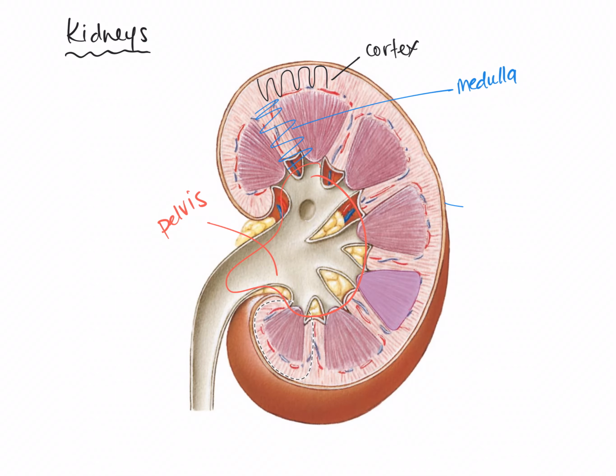Before we move on to the next slide, I'd just like to remind you that the cortex area is heavily vascularized. So this is where most of the filtration and most of the reabsorption will occur.